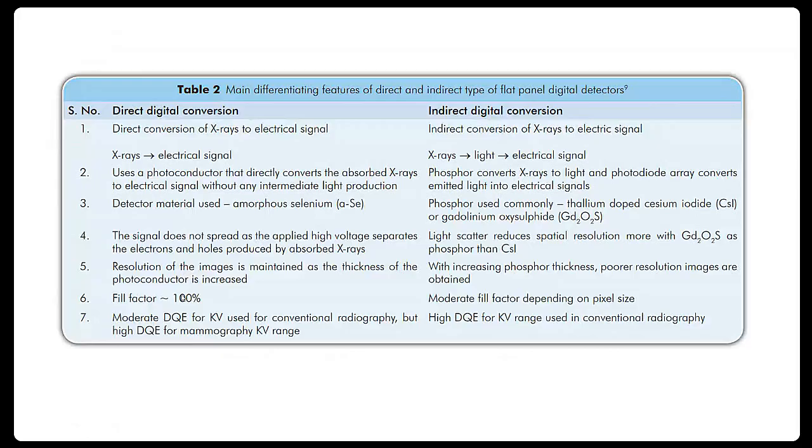So what does a fill factor of this much percentage indicate? Suppose for indirect digital conversion, the fill factor is around 80 percent. What does that mean? It means that 20 percent of the pixel area is occupied by the detector electronics, with 80 percent representing the sensitive area.